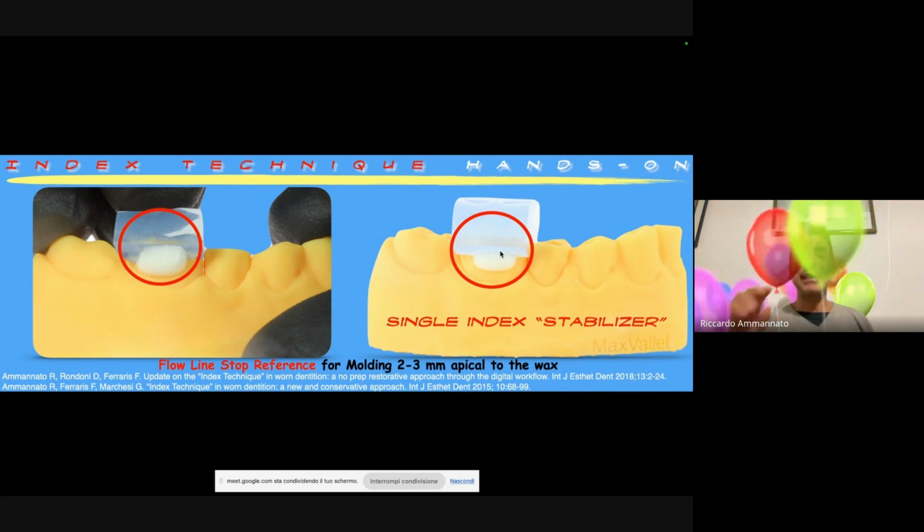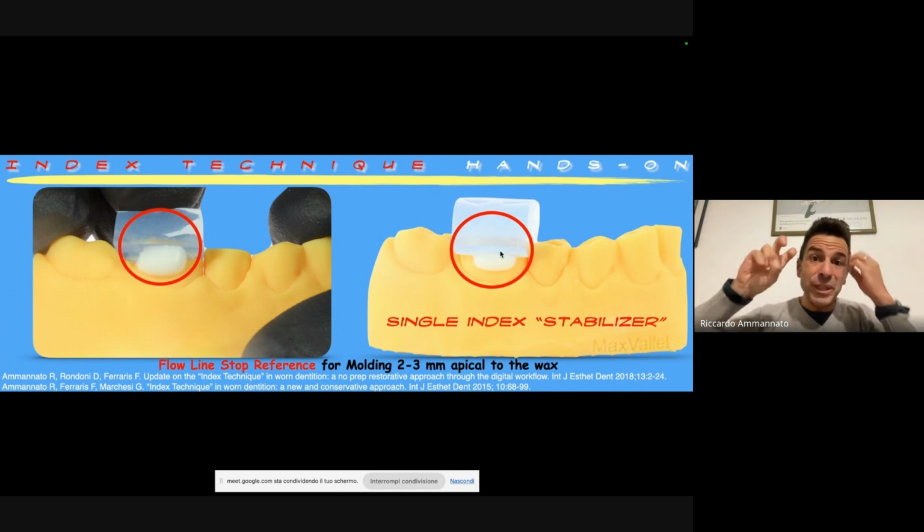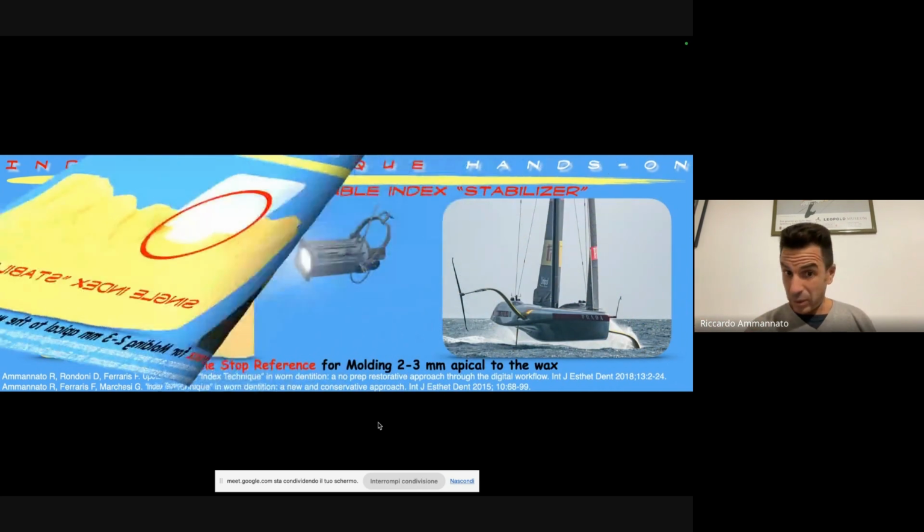One is a physical stop, because while I'm molding, while I'm landing on the tooth to do my molding, I have a physical stop that will stop my index, so will stabilize my single index. And the other advantage is a visual advantage, because while the clinician is molding, I can see that I've reached the correct position, because the index is kissing the flow line stop reference.